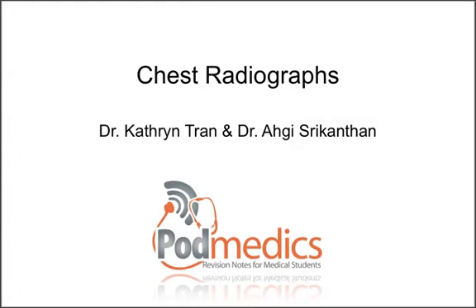We're going to present one of two podcasts on chest radiographs. Today we're going to talk about the basic anatomy and basic interpretation.